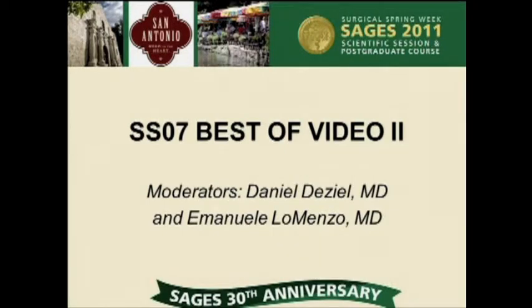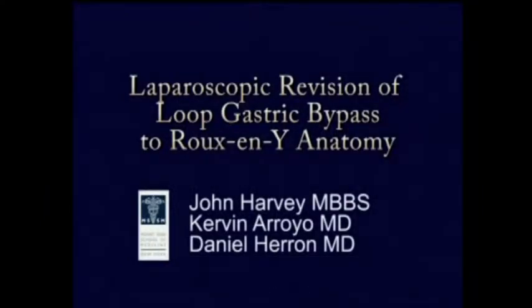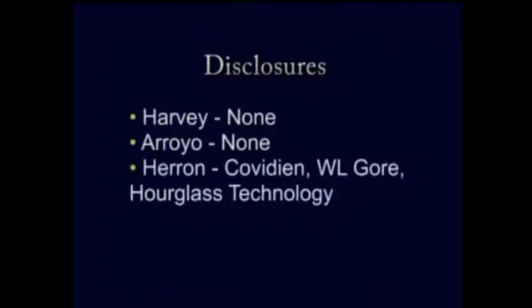This patient had been super morbidly obese with a body mass index close to 60. He had gone elsewhere to have a mini gastric bypass or a loop gastric bypass performed, and he came to us sometime afterwards for a revision.